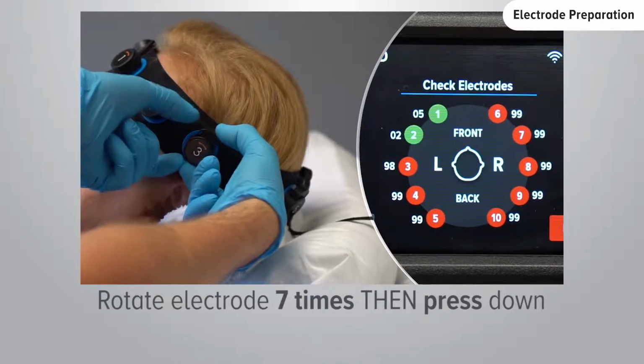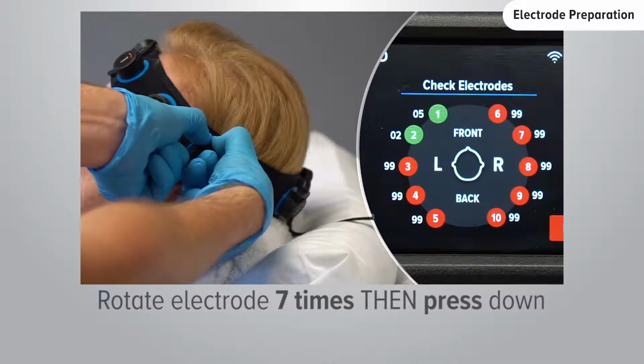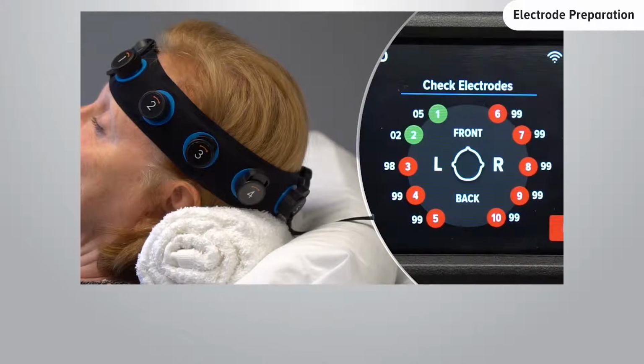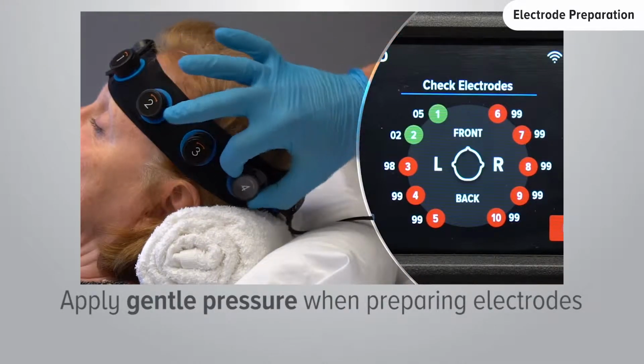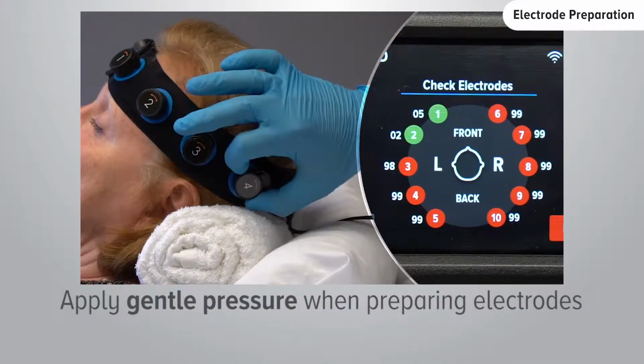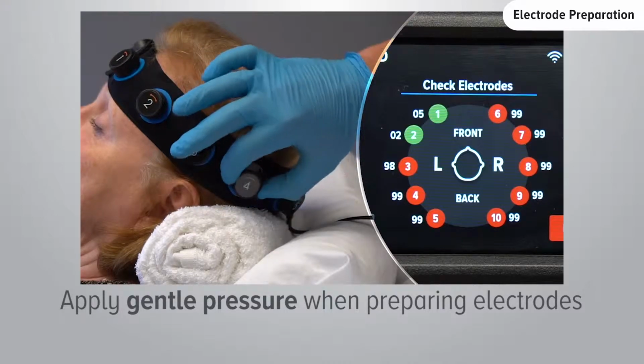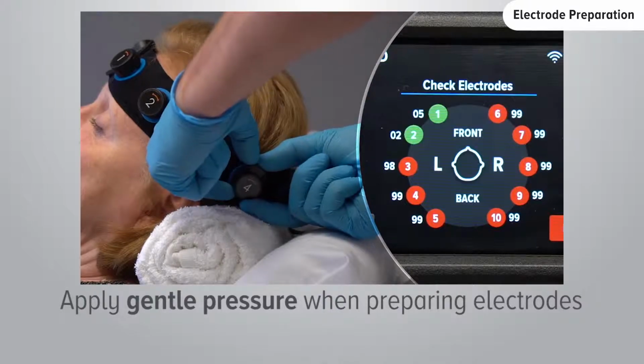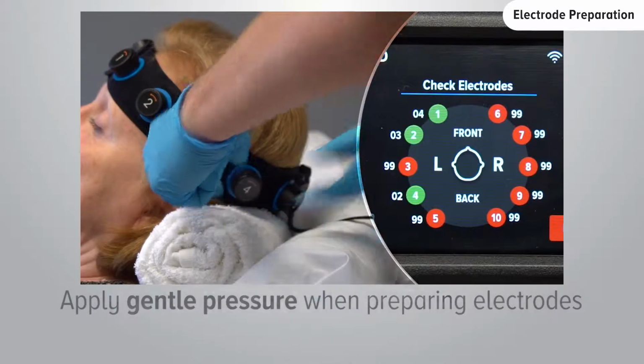Firmly squeeze the plunger into the knob with both thumbs using full force. This dispenses the conductive electrode gel. As you dispense the gel, be sure to continue applying gentle pressure towards the patient's head. Repeat this prep process for the remaining electrodes.